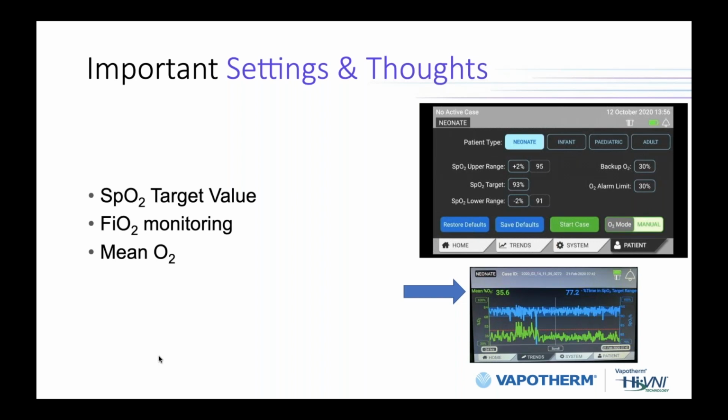Today, if you want to know how much oxygen my patient needs, you will look at your precision flow and the FiO2 will tell you, well, my baby needs 28%. That's also the value that you use for your hourly observational documentation. Using a closed loop controller like OAM makes the FiO2 display on your precision flow pretty much useless because the number can change up to 100 times per hour because the controller increases and decreases the FiO2 all the time.